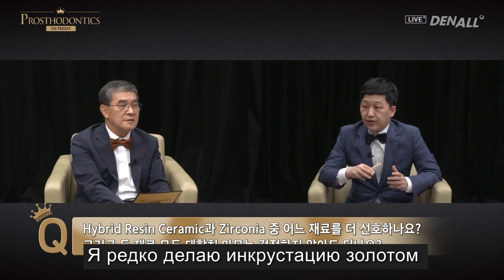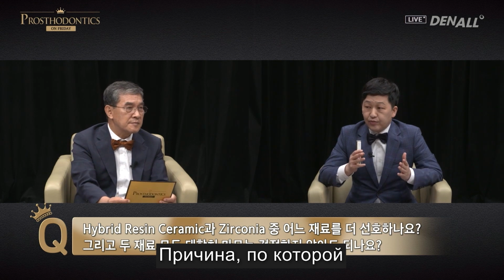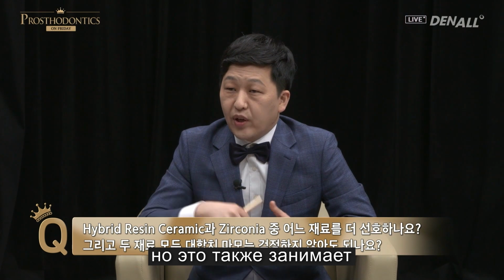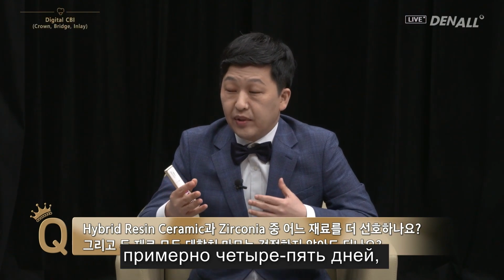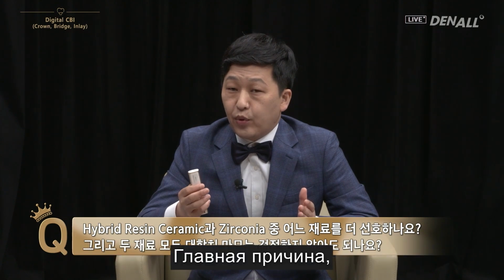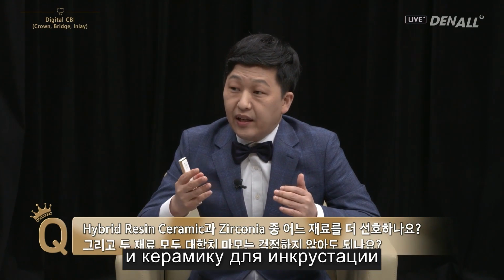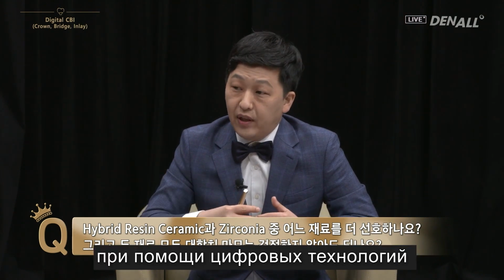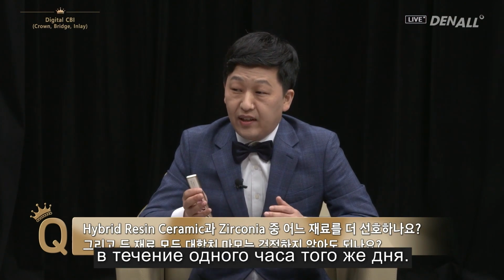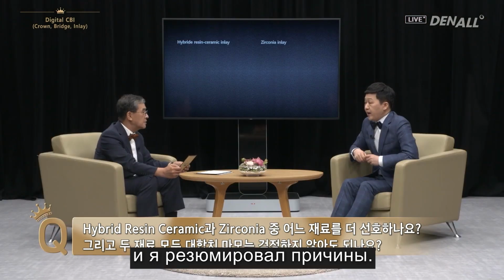I rarely did gold inlays or gold crowns. The reason I don't do gold inlays is not only because of cracks, but it takes approximately 4 to 5 days until the prosthesis comes after the impression is taken. The main reason I use hybrid resin ceramic for inlays using digital technology is because I can complete the restoration within 1 hour on the same day. That's why I don't do zirconia inlays, and I have summarized the reasons.